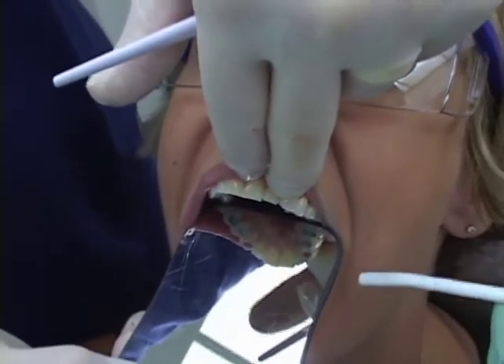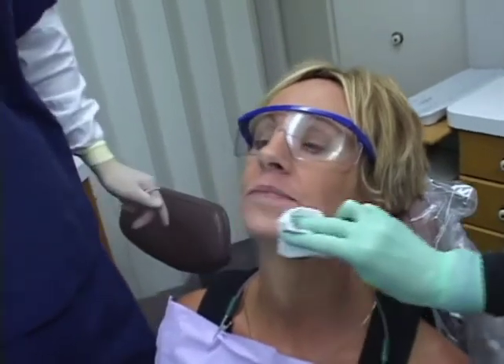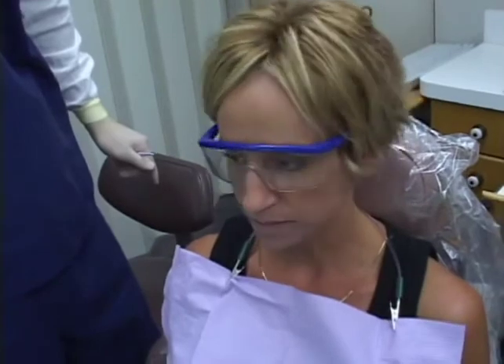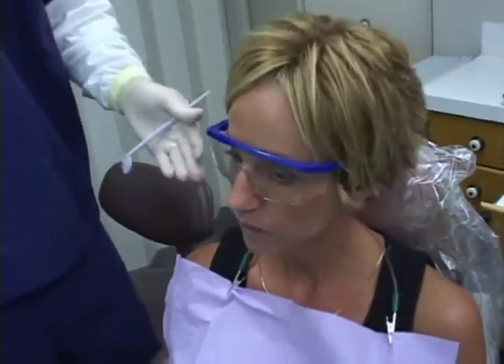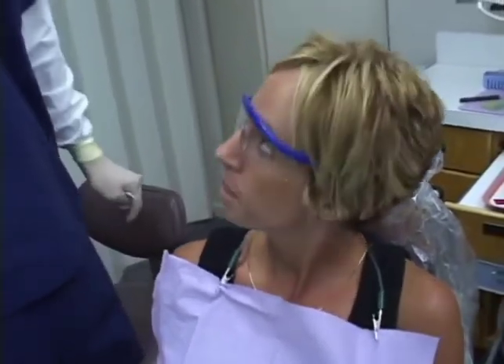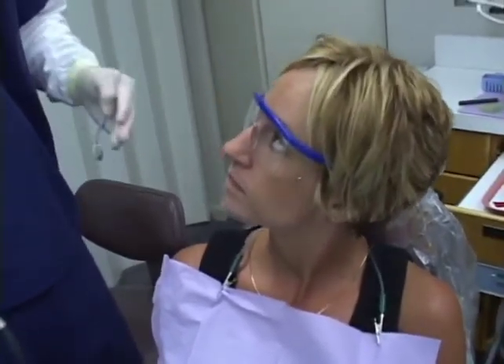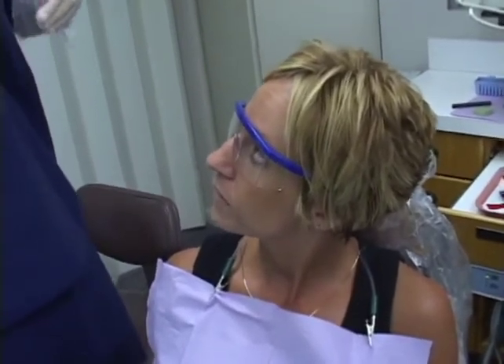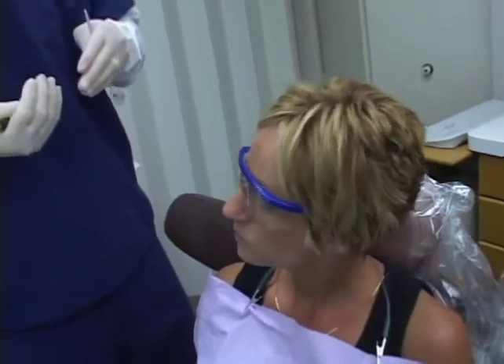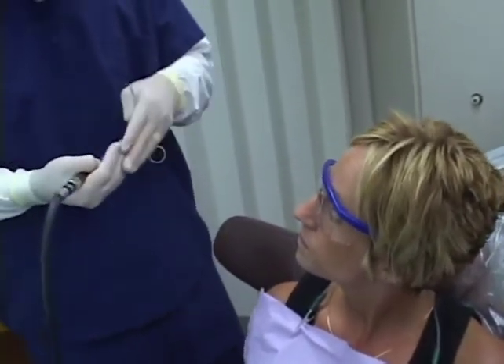The question becomes: are those guidance contacts on 6 and 11 too heavy? How do you feel, Debbie? Are you aware of those teeth at all? Do you feel like you're banging into 6 and 11? - Not at all. If she were concerned, we'd reevaluate this. We see nice heavy guiding contacts, but the question is whether there's any frictional relationship that's harmful to those teeth. It's that very fine balance between being protective and guiding versus being destructive.